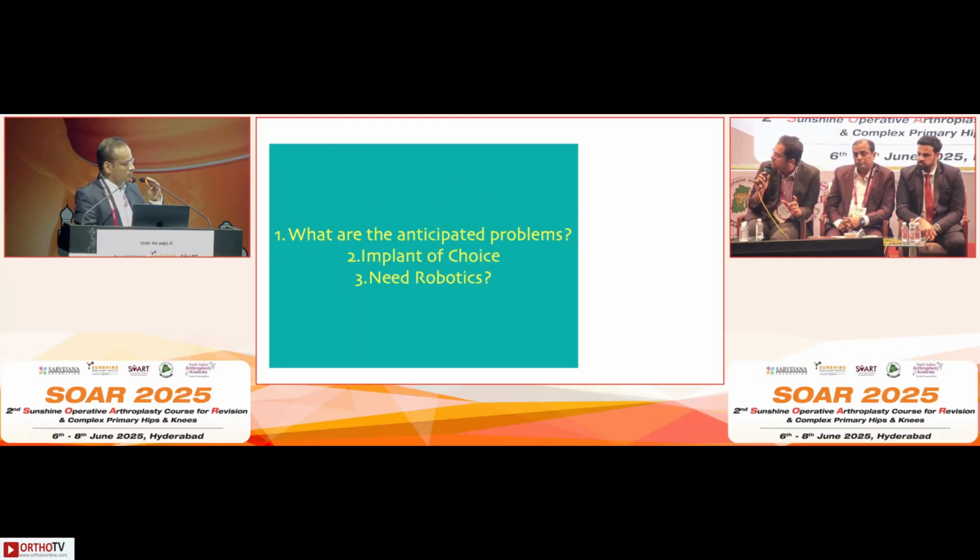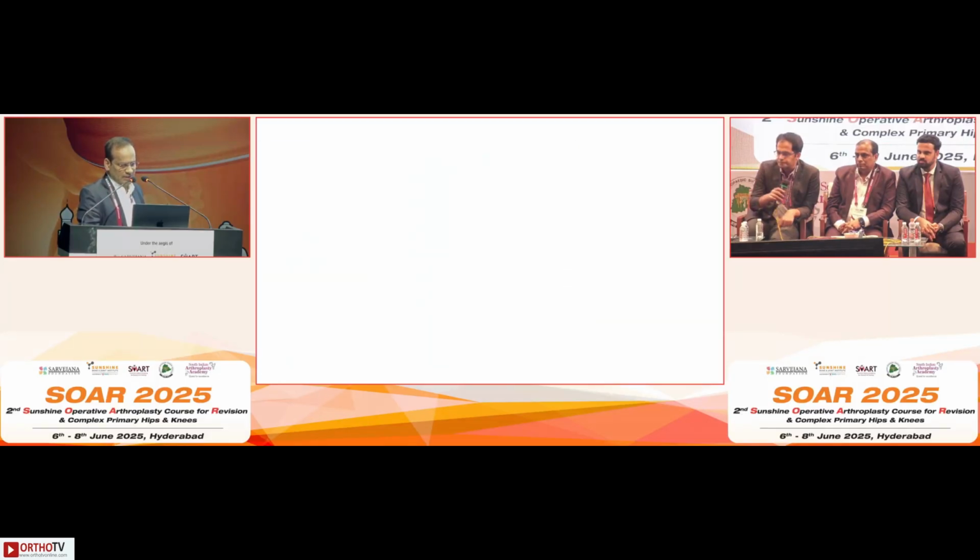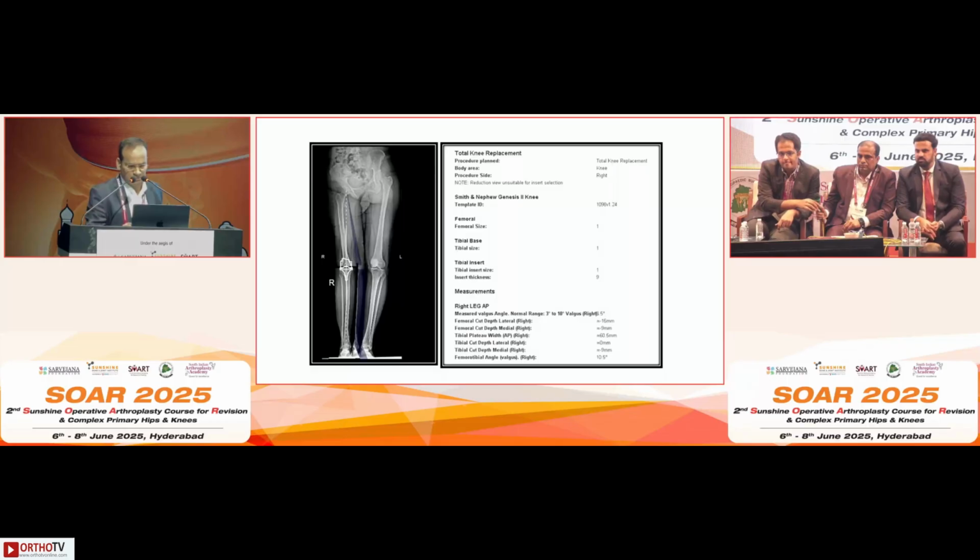In Indian sizes, the GK is a butterfly. That is a system which, among constrained implants, has a very small hinge. Is a customized implant available? Yes, customized implants they do. So nowadays there are a lot of options, but off the shelf, Implantcast is the one; it goes down to even size 49 mm. Because we anticipated this, we went with templating; otherwise we usually won't do templating. The femur is around size 1 of the Smith & Nephew.